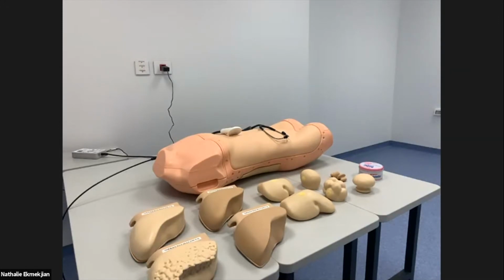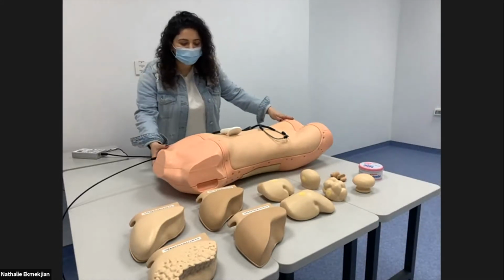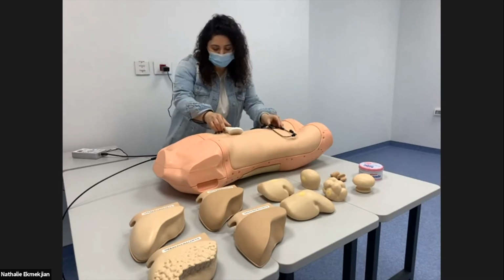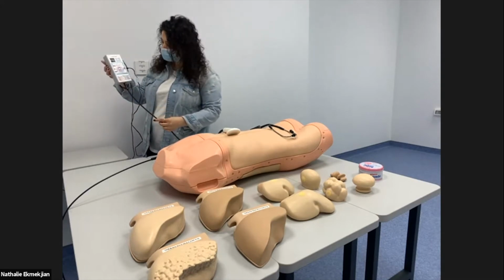Now I will move to the product demonstration. So just a quick recap. This is our main torso, along with the simulated stethoscope that is linked to the controller.